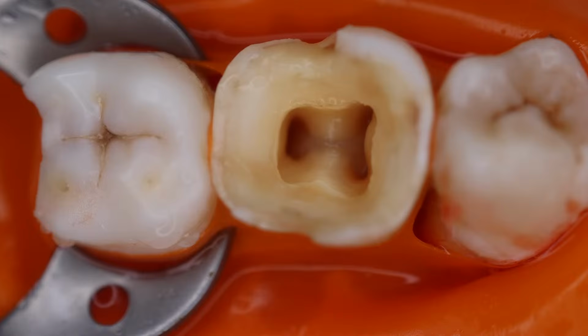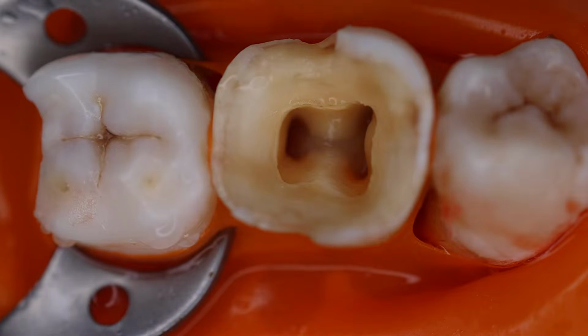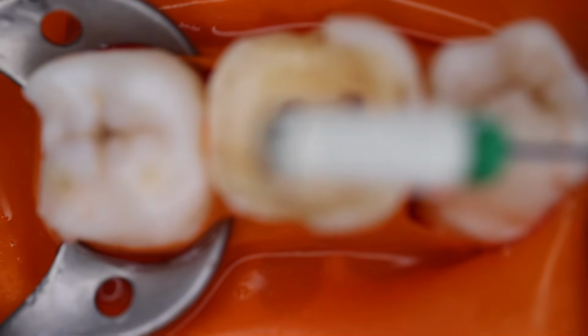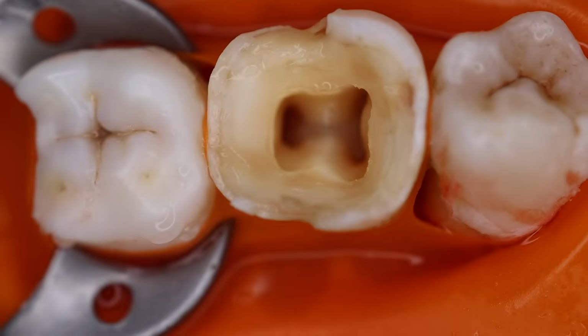Since these canals look a little larger, we can use these reamers. Let me show you the reamers. This is a 15K reamer.